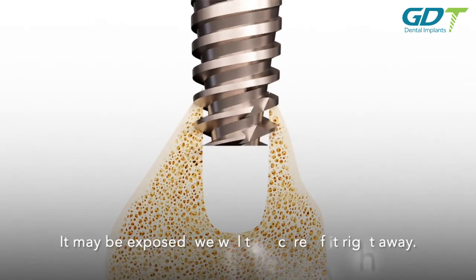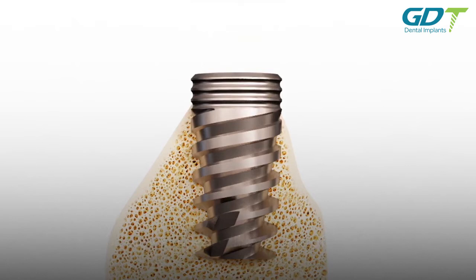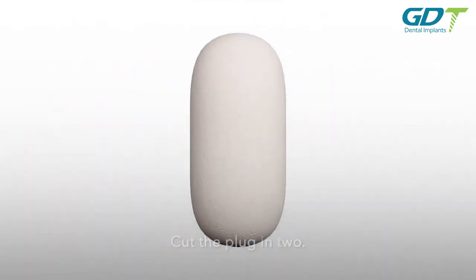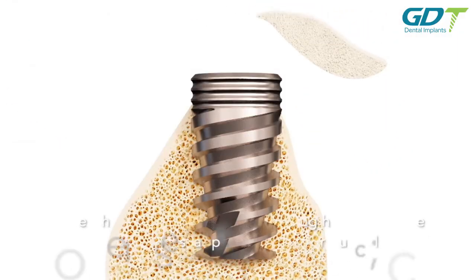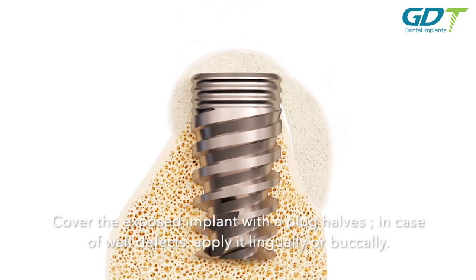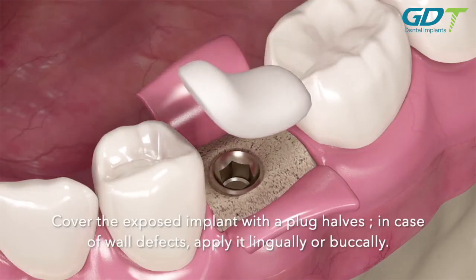If the implant surface is exposed, address it immediately. Cut the plug to cover the exposed implant with plug halves. In case of wall defects, apply it lingually or buccally.